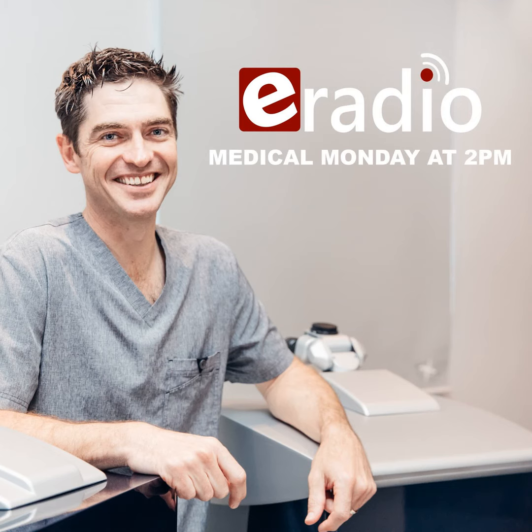And as I said last week, laser vision correction, or ophthalmology, is one of those fields that is expanding at an incredibly rapid pace. So once this LASIK flap has been created, we then move you under the second laser, the one I referred to right at the beginning. That's the excimer laser, the excited dimer laser. Now, what this laser does, and this is the crazy thing, the science behind it was developed by NASA scientists.